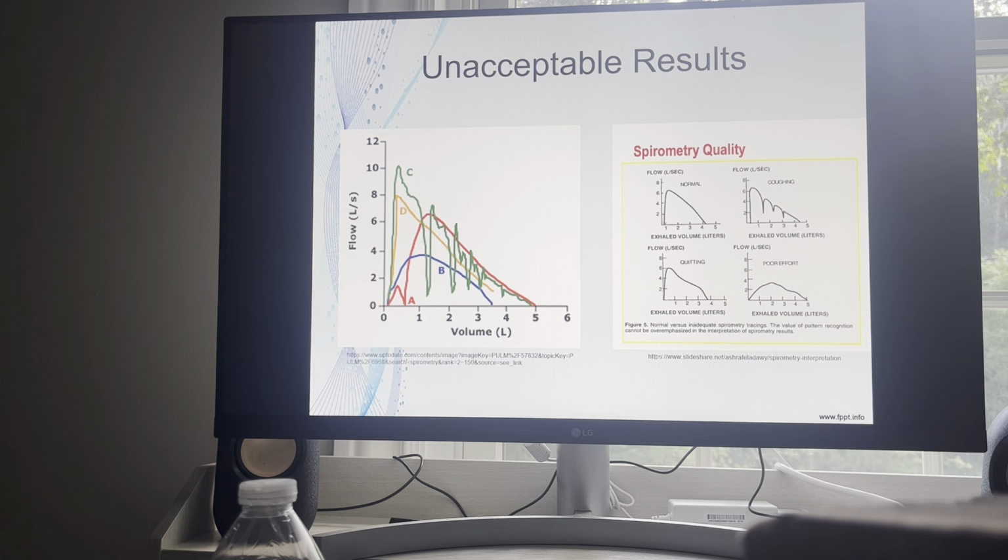So phase 1, coach the patient to inspire as deeply as possible after a few normal breaths. And then phase 2, tell them blow, blow, blow, keep blowing, keep blowing until you get to 6 seconds. Wait a few minutes and repeat for 3 efforts.